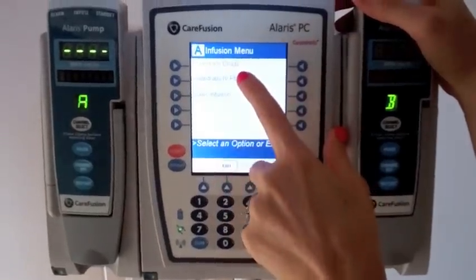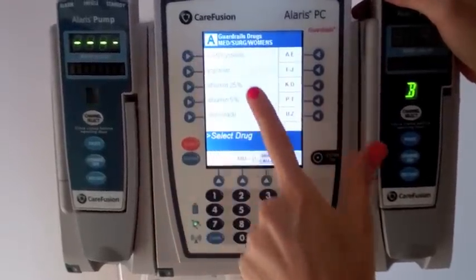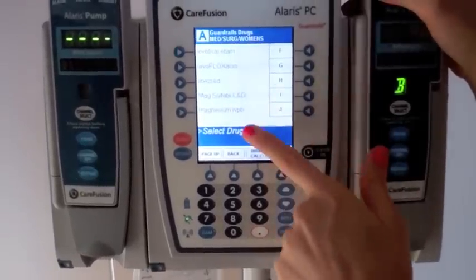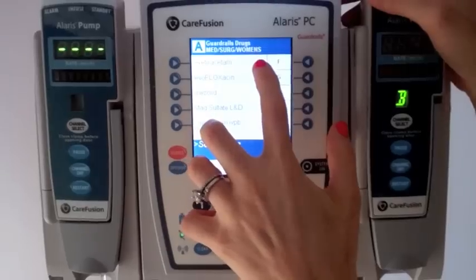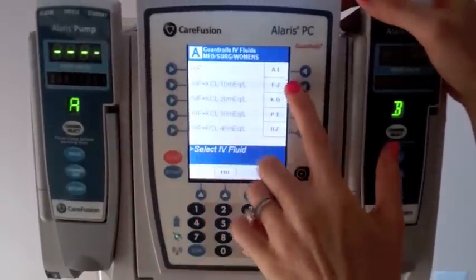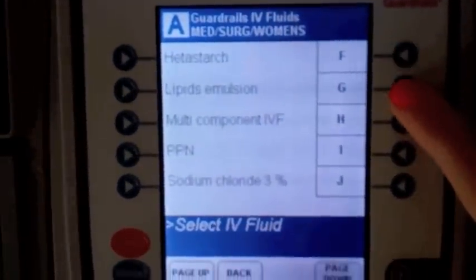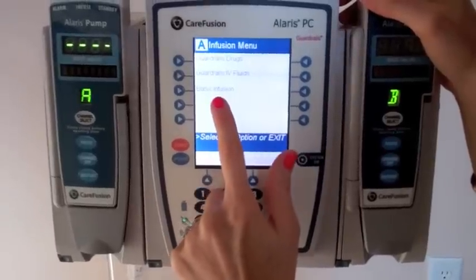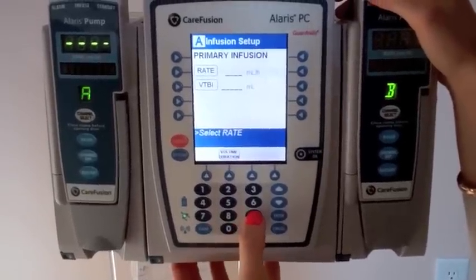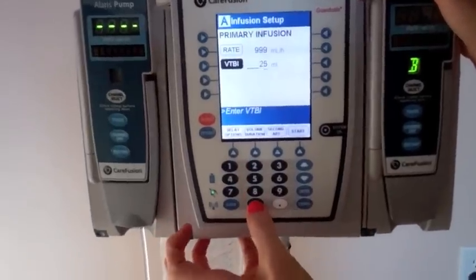Then it gives us three options: guardrails drugs, guardrails IV fluids, or basic infusion. If you click on drugs, it'll give you all of the medication options available on a med-surg floor. If we go to IV fluids, it'll give us all of the fluid options we can deliver on the med-surg floor. Basic infusion really should only be used if you have to bolus fluid in — if you have an emergency and need to bolus some fluid in quickly.